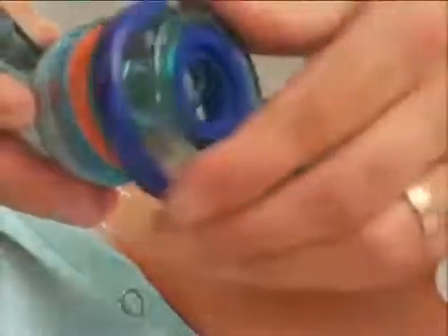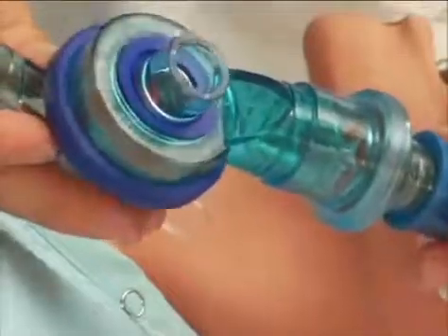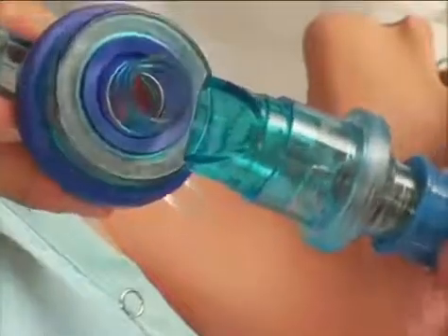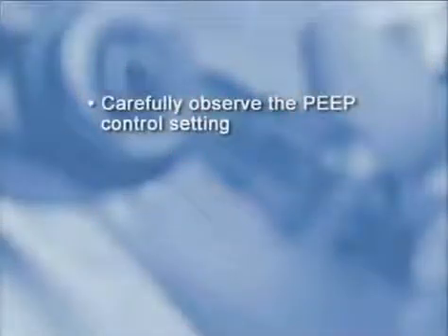As an external option to the patient circuit, you can apply PEEP, positive end expiration pressure. The exhaust collector adapter lets you attach a pop-off type PEEP valve to the exhalation port of the patient valve. Because the inflation pressure manometer will not indicate exhalation pressure, you should carefully observe the PEEP control setting.